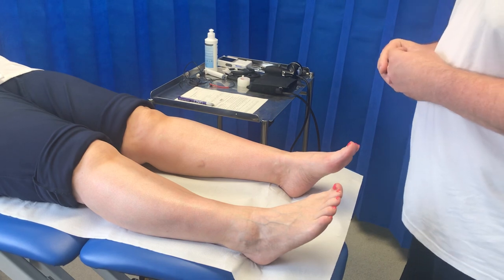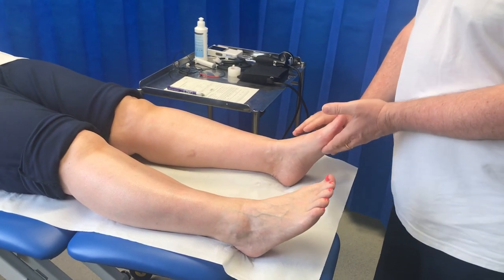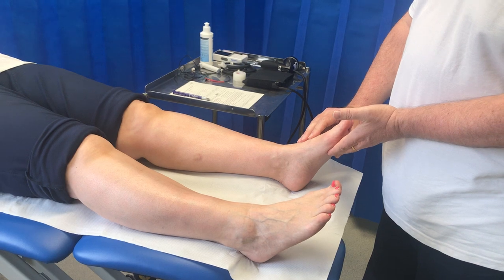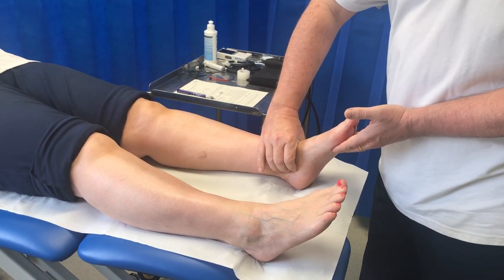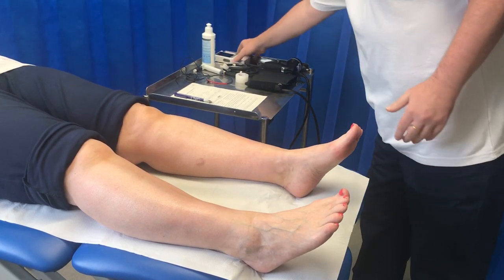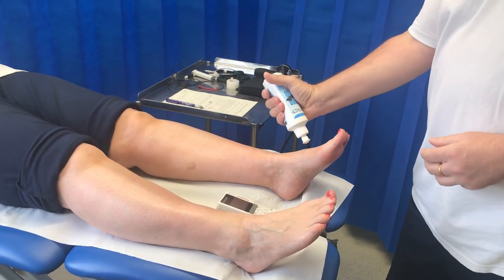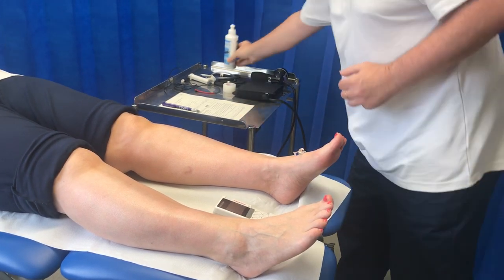I've taken a brief cardiovascular history and I'm now going to examine the limb. First, I will palpate for dorsalis pedis pulses, which are usually going to be non-palpable in the critical limb ischemia situation, and the posterior tibial pulse behind the medial malleolus. I'm then going to use my Doppler to listen to the pulses to see if they are monophasic, biphasic, or triphasic.